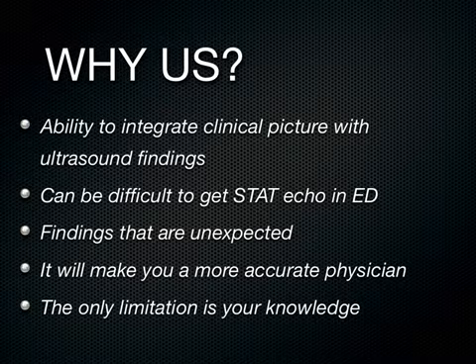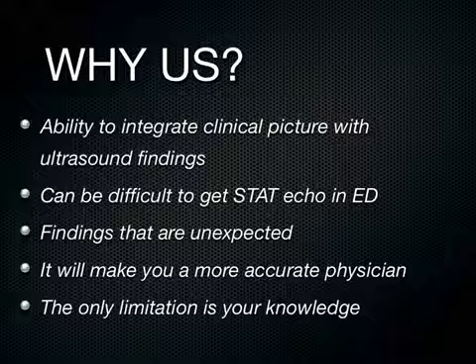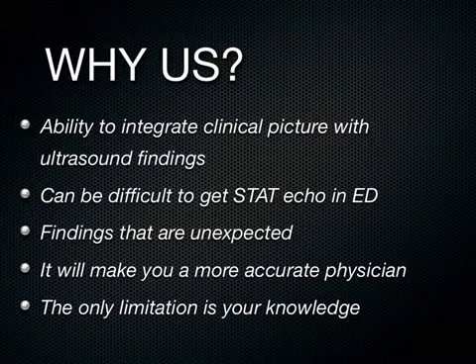So this was an undifferentiated patient. The medical student just happened to be scanning, going bed to bed, and picked that up 2 days ago. Would that have been discovered with a thorough history and physical? Yeah, maybe, maybe not. Maybe it would have been delayed for a few hours, but the patient immediately went and had this procedure done 2 days ago.